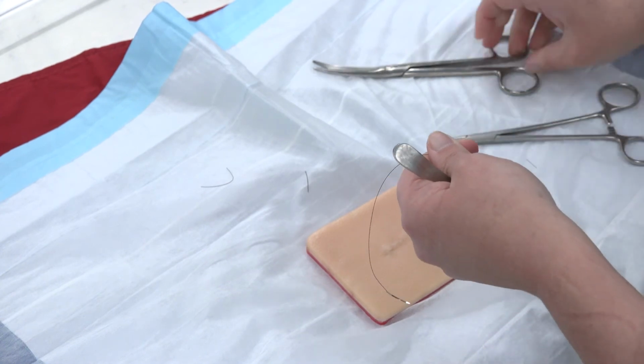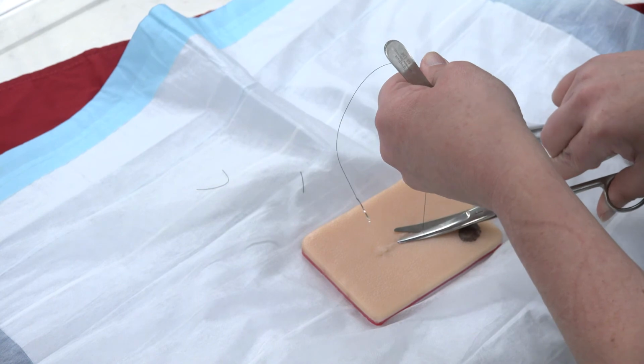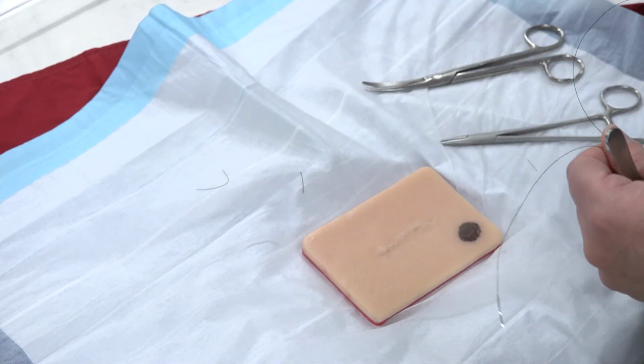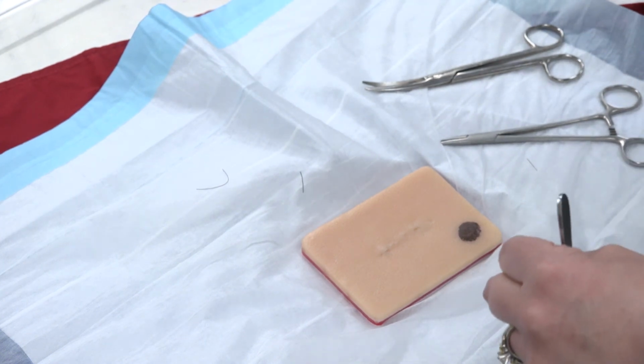So the knot's upside down. Then you pull this tight. You don't want to be loose. You want to pull it tight and then cut it right adjacent to the skin. It should pull the suture back in, and you're golden. Everything's buried. That was longer than 3 minutes. That was forever.